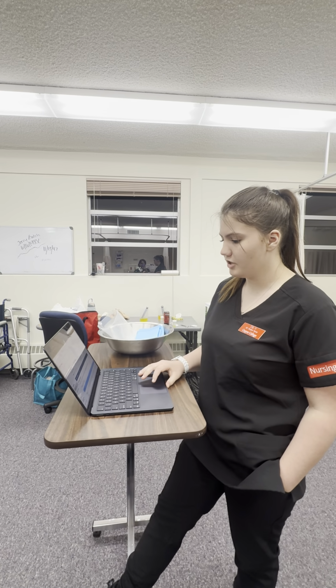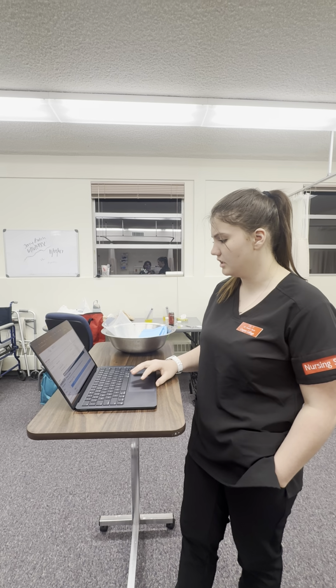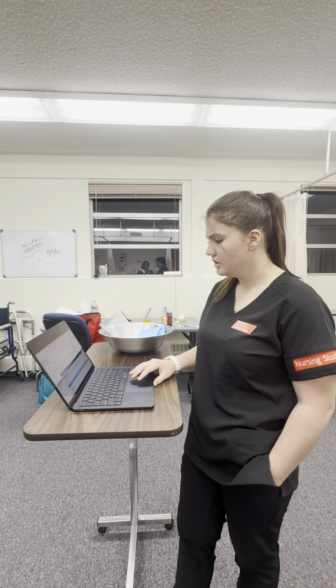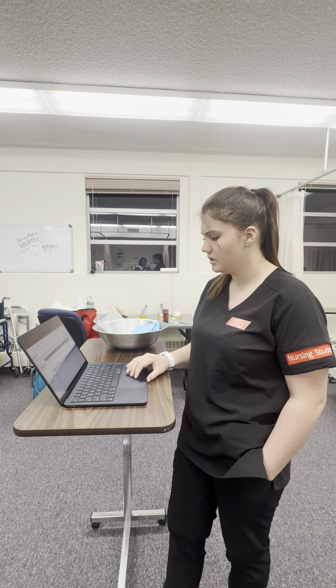Okay, we're looking at our patient Jerry Batch today. He's a male born 6/16/19XX. He's a full code status. Looks like he does have an allergy to betadine, so we'll want to keep that in mind.